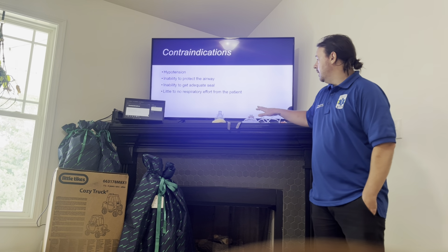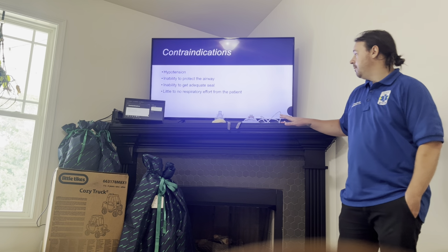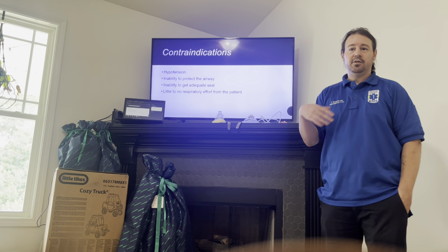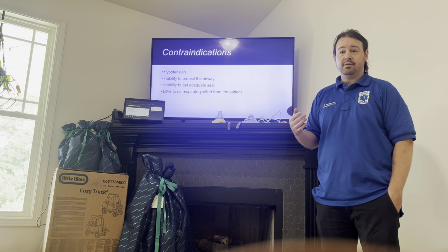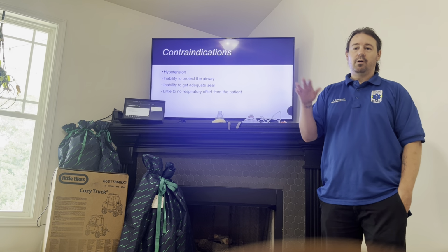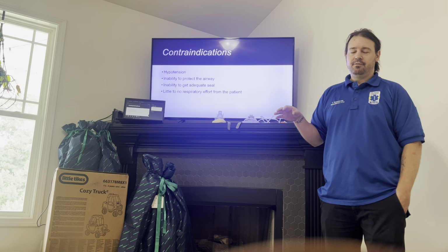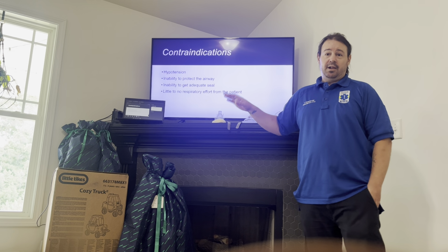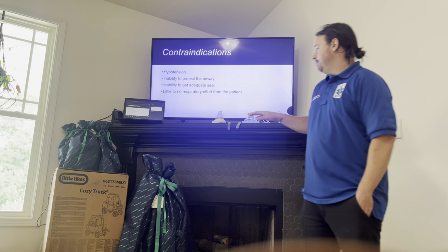Little to no respiratory effort from the patients will be a contraindication because they still need to be breathing for this to be effective. We are going to apply positive pressure to their already normal respiratory drive. So if the patient is not breathing on their own, we need to move to ventilation. We would no longer use CPAP.